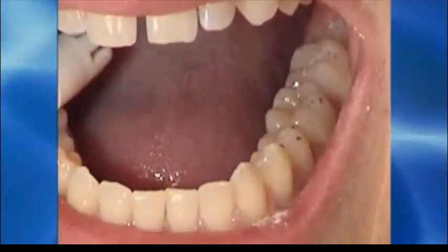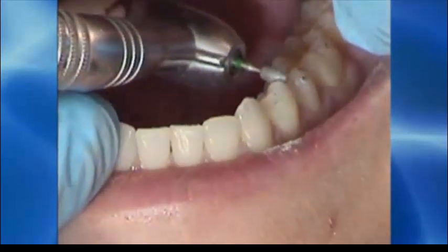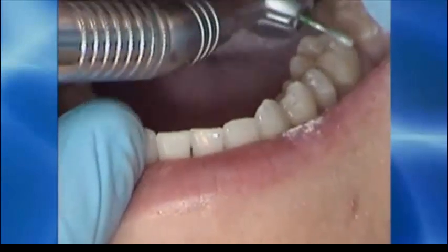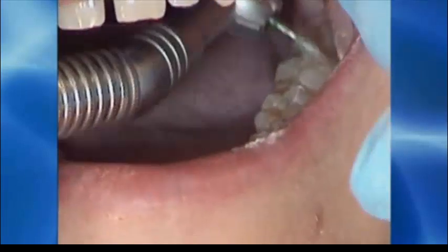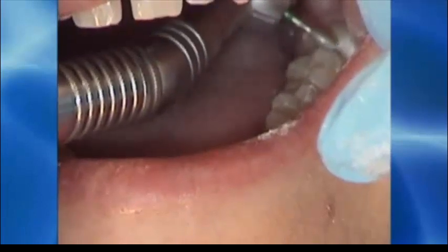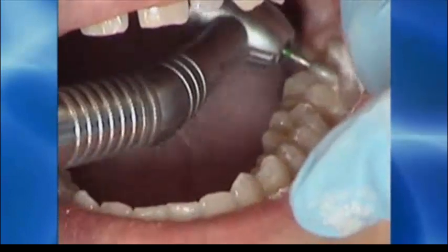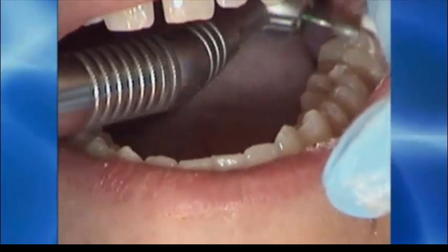On the opposing lower teeth, there's contacts that make up the long disclusion on the buccal aspect of all the posterior teeth. Here you see I'm working on the premolars, now the distal aspect of the first molar. And what I'm doing is I'm trying to remove the contacts that are down on the buccal surface and shave the cusp back to eliminate the friction that's there and taper the shape of the tooth to the contact that's at the cusp tip. Here you see I'm refining the second premolar and then again the buccal aspects of the two molars. And now I'm going to treat the balancing incline on the distal buccal cusp of the lower second molar.